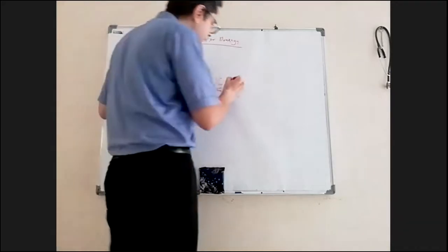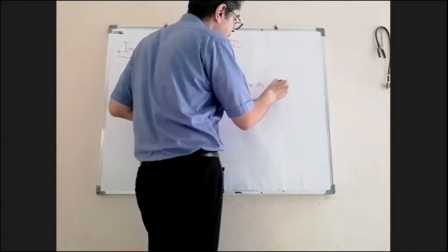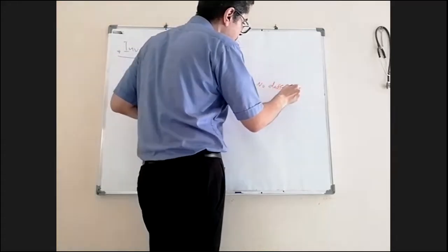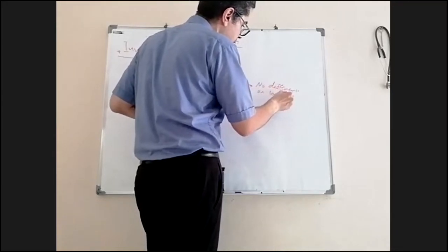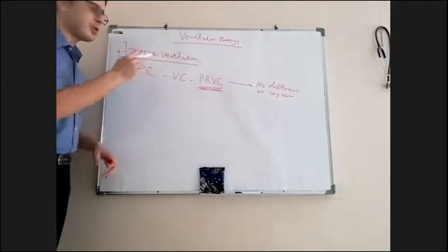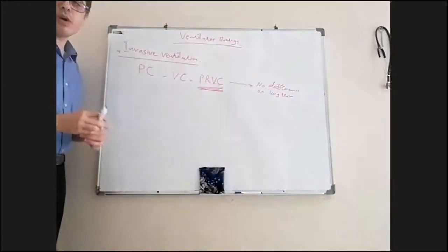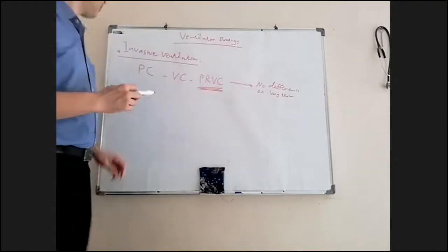But on study, they found no difference in the long term. So you can put your protocol as you like: volume control or pressure control or PRVC. Once you provide adequate care, there is no difference in the long term.